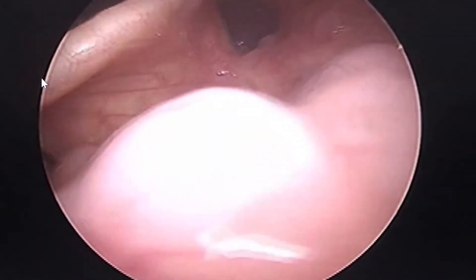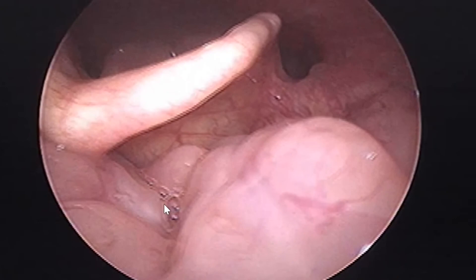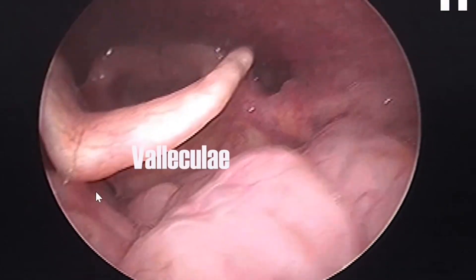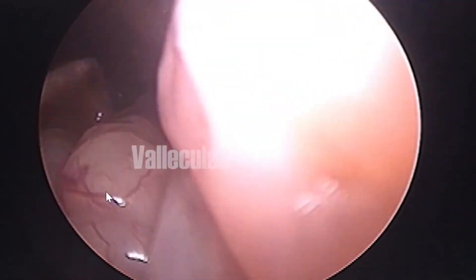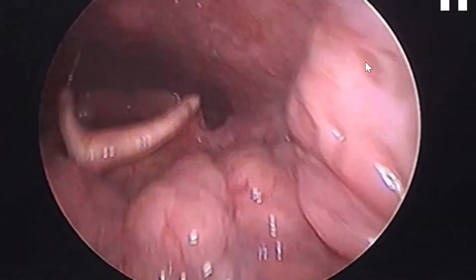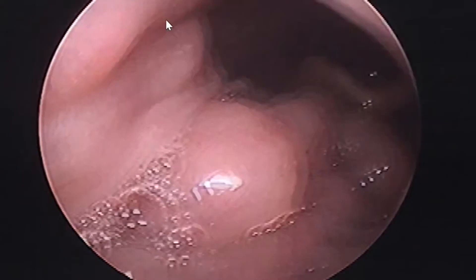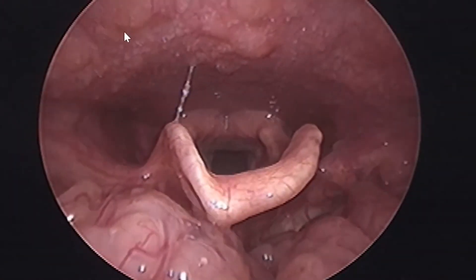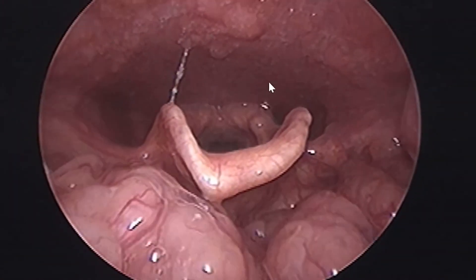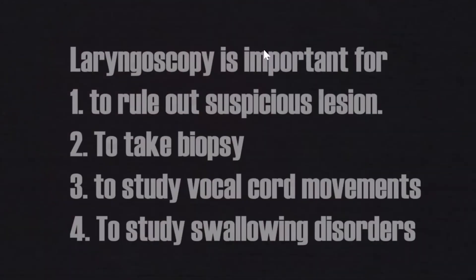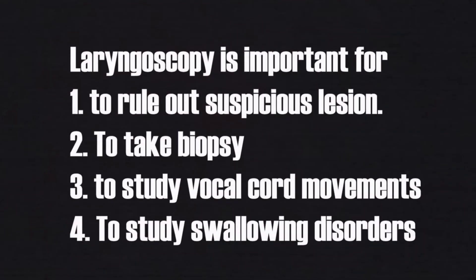The vallecula is a hidden space behind the epiglottis, between the tongue and the epiglottis, with prominent lymphoid follicles visible here. It is essential not to miss any growth or foreign body lodged in the vallecula. These are the tonsils, which have crypt-like structures and sometimes white debris over them, known as tonsil stones. You can also see the posterior pharyngeal wall, which had some granulations.